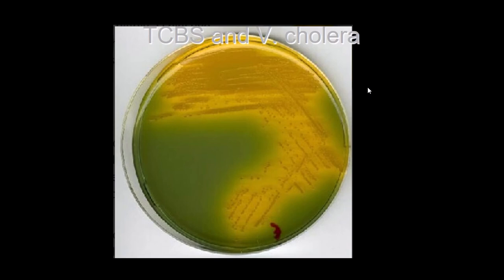So in isolating Vibrio cholerae, we have to use a selective media after taking rectal swabs.